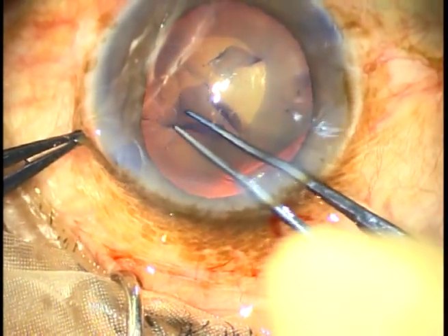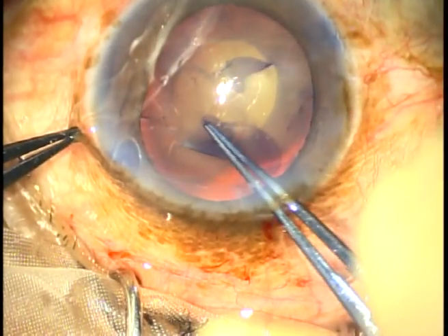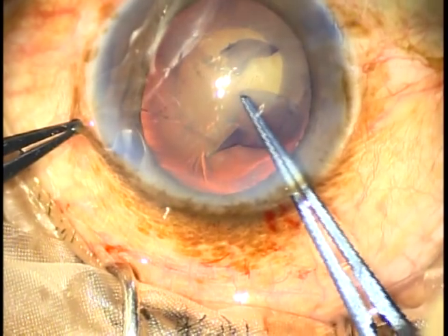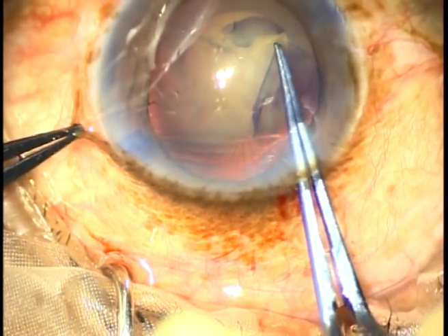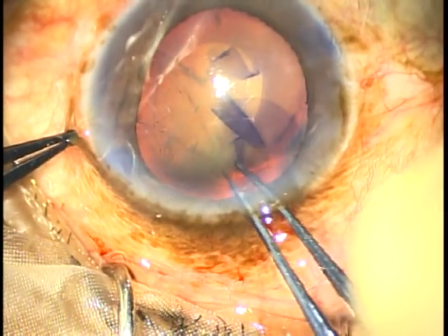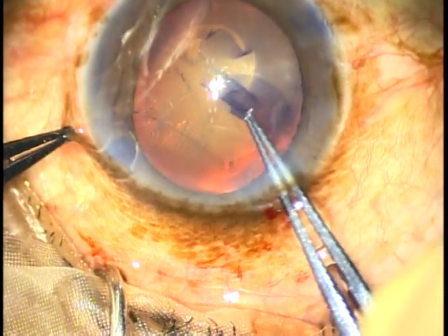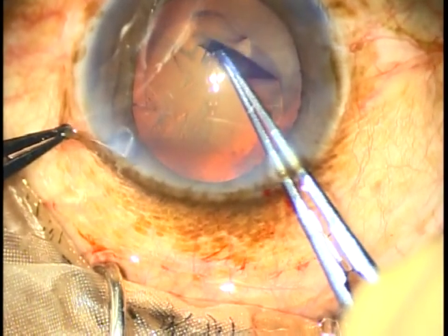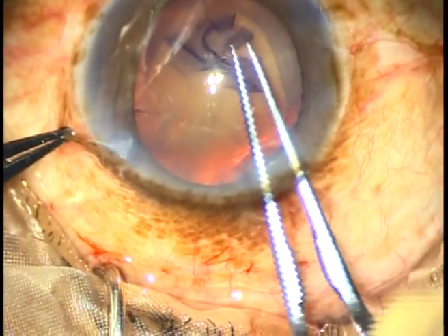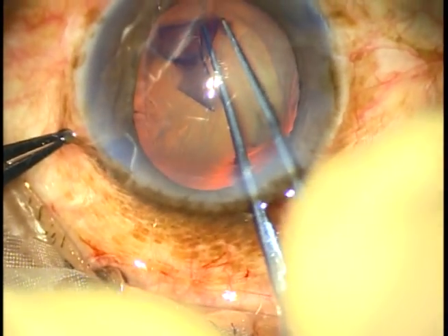Here I leave and re-grasp, and I am trying to do an optimum-sized rhexis. You can see that vitreous strands are coming towards the main incision. As there is some leakage of HPMC, vitreous strands are coming superiorly.